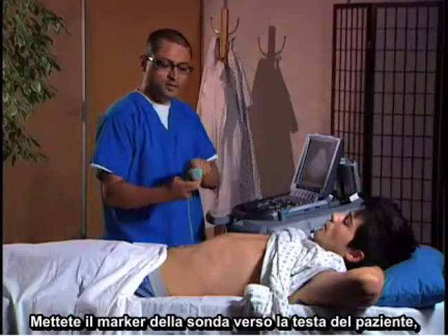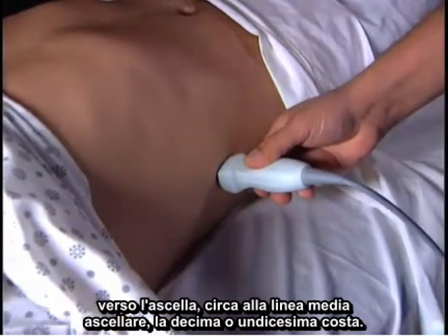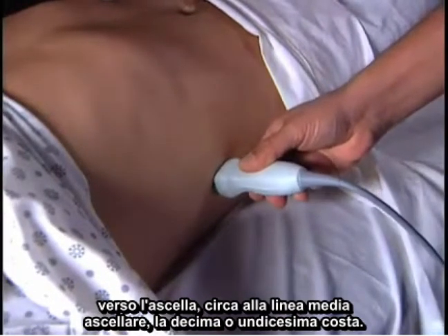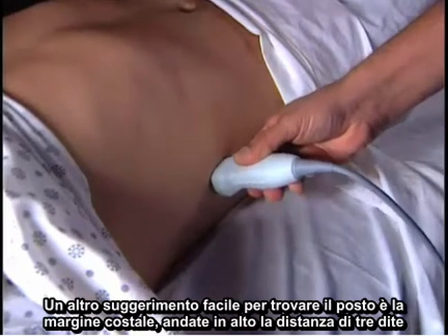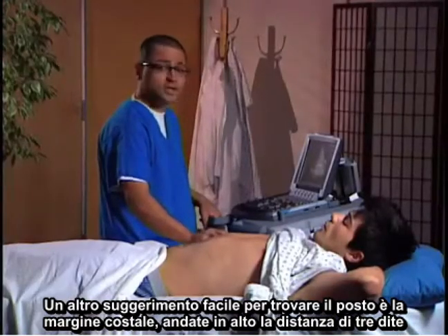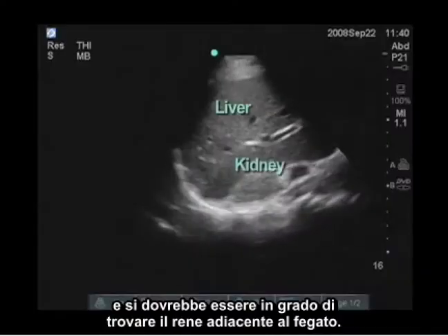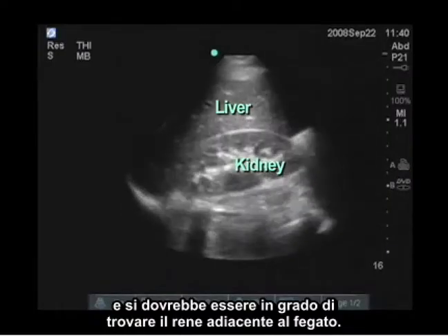I like to put the probe marker toward the patient's head, toward the axilla, at about the mid-axillary line at the 10th or 11th ribs. Another easy tip to find the location is to get to the costal margin, go about three finger breadths above it, and you should be able to find the kidney and see the adjacent liver.